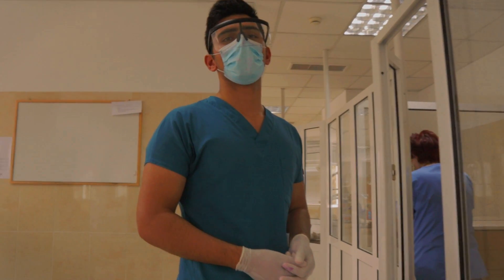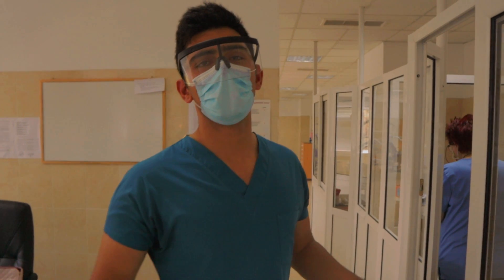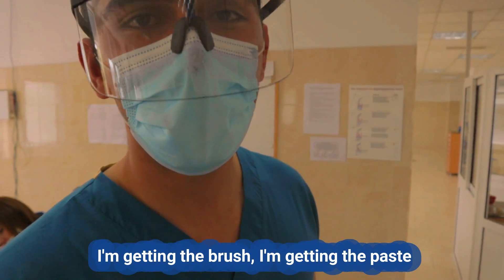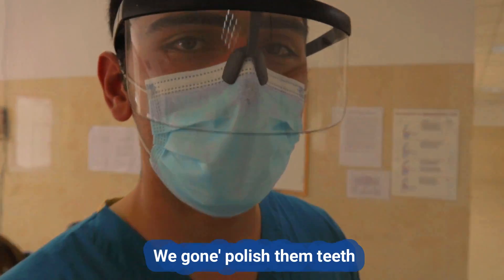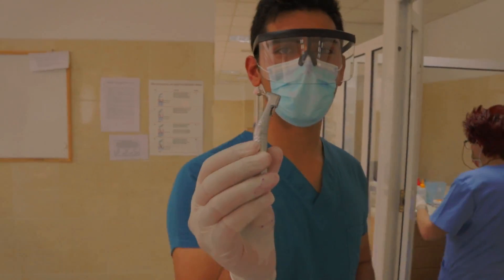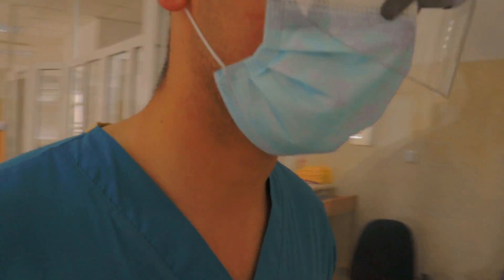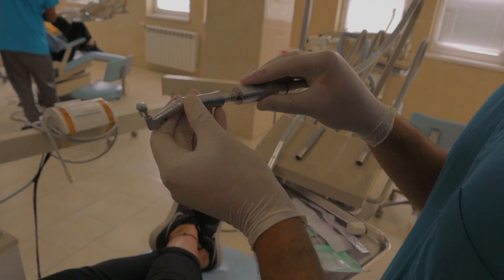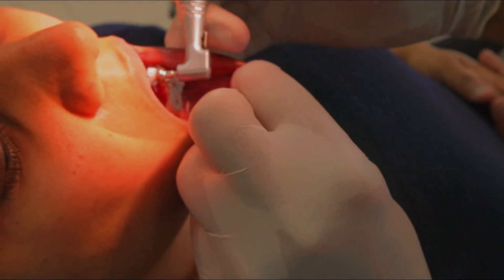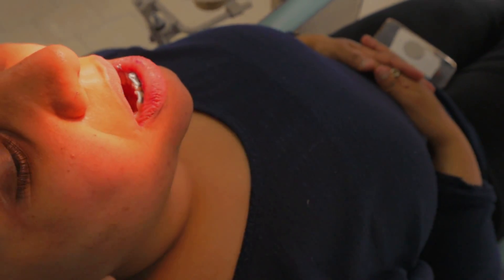The last stage of cleaning was to polish the teeth using polishing paste and a brush on the slow handpiece. Right now I'm getting the brush and the paste — we're gonna polish these teeth. Cleaning done, absolutely shiny — but that's what the patient thinks at the end. It's a slow handpiece with a brush on it and we got some polishing paste. My teacher started shouting at me because I went overtime, but I just finished polishing and I was done.